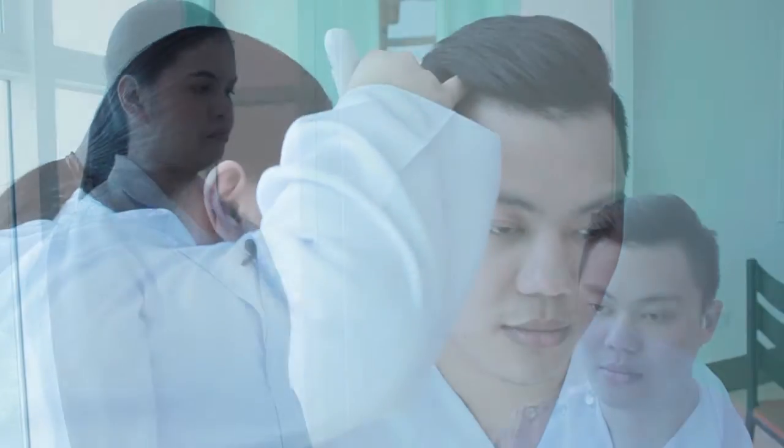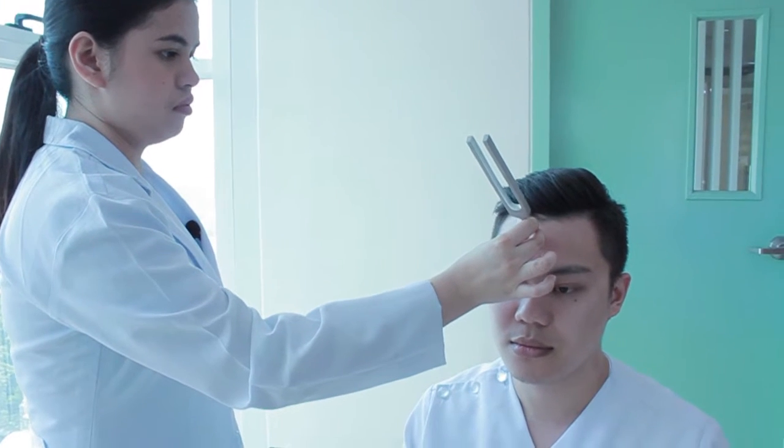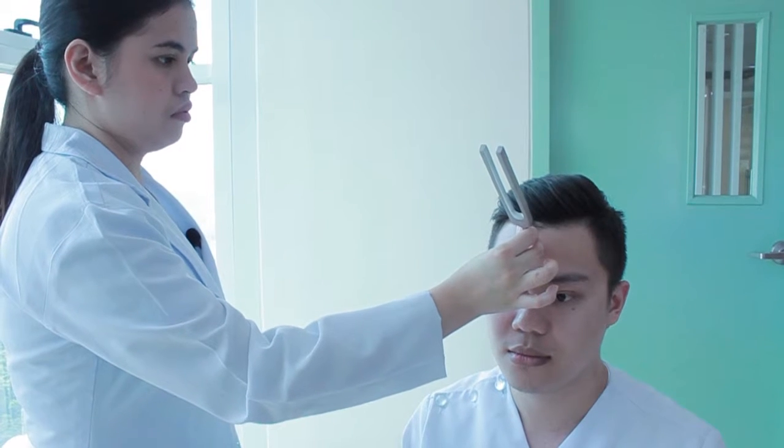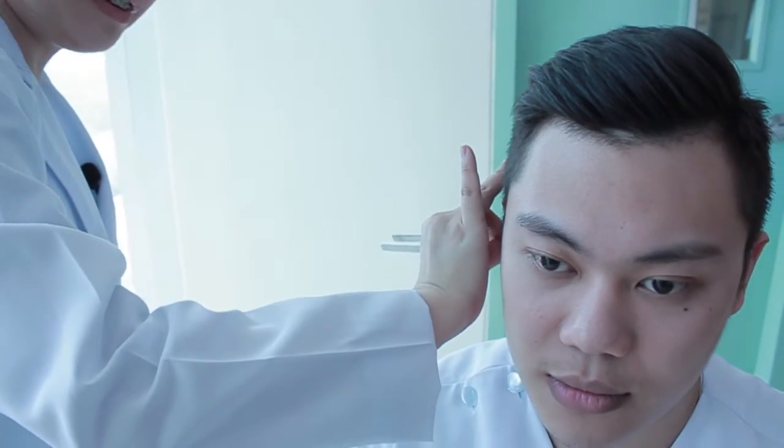Tuning fork evaluation of the ear may be done but is often of limited value. In the Weber test, the tuning fork is placed on the forehead, the bony nasal dorsum, or the front teeth. Ask the patient to tell you whether they hear the sound louder in one ear or the other. Do you hear the sound louder in one ear or equal on both ears? Equal on both ears. Equal in both ears or they cannot localize the sound at all.